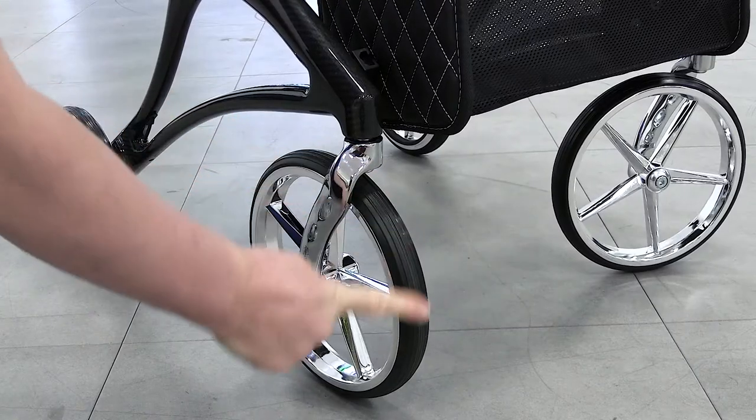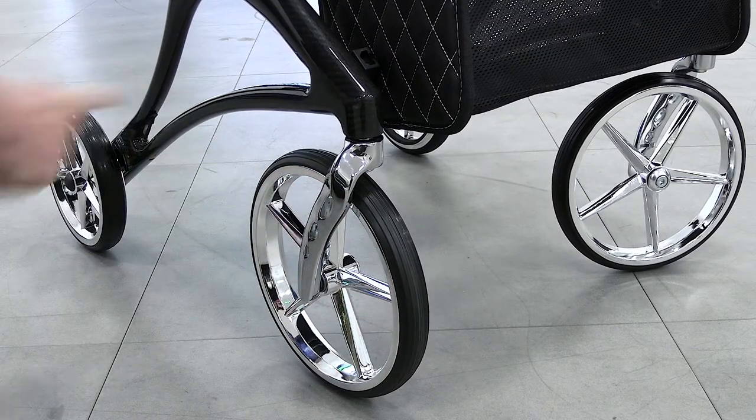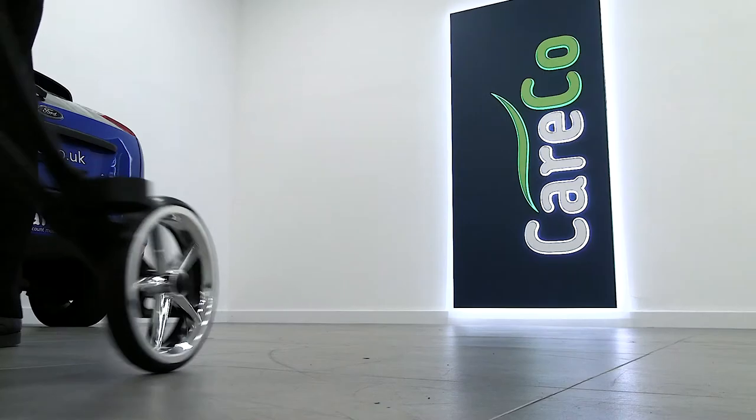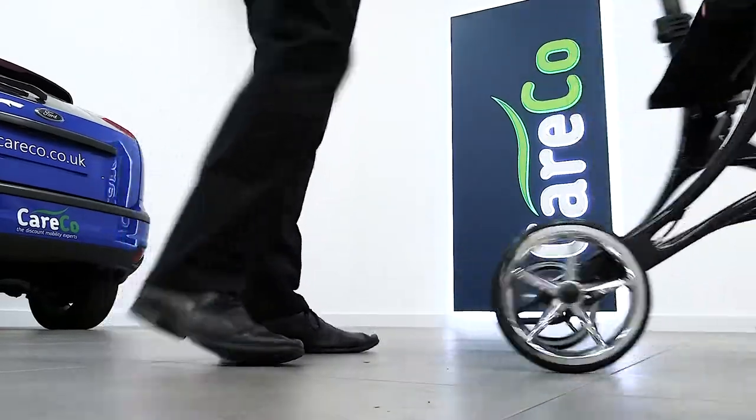The Carbon X is all about clever design. The front wheels are slightly larger for a more graceful stride, while the caster fork design on the front wheels allows for a smaller turning circle, ideal in narrow rooms or busy spaces.